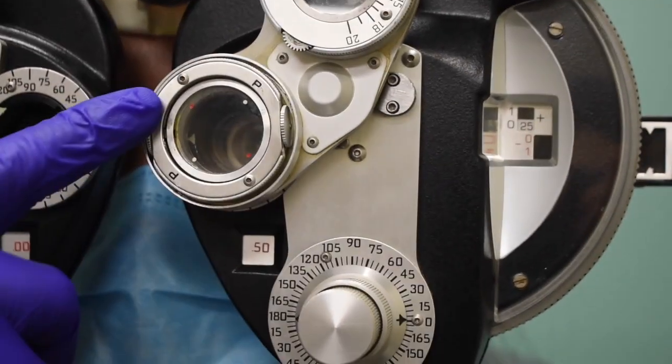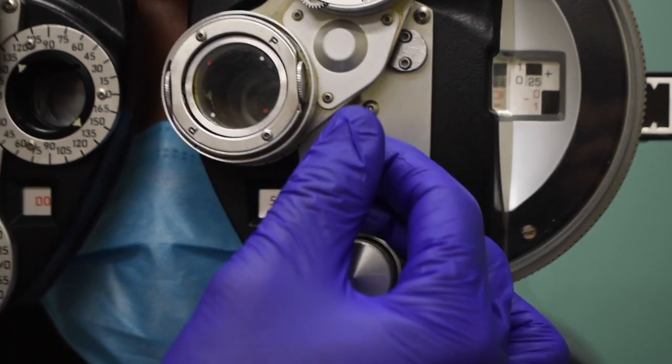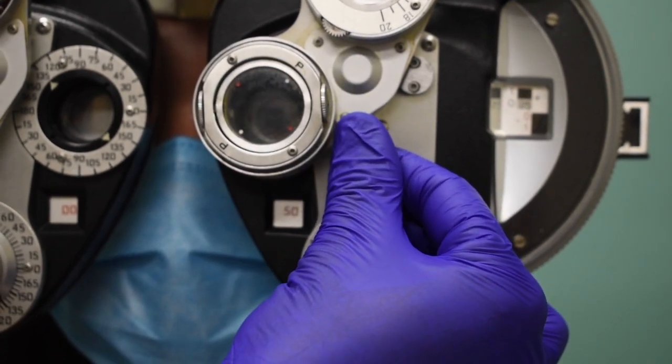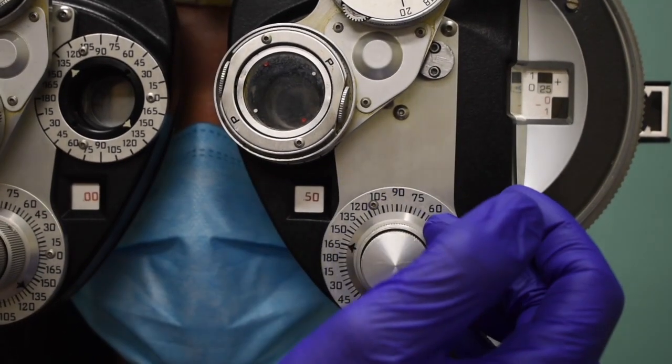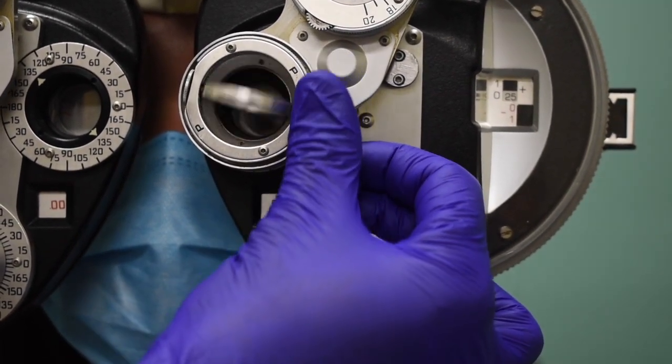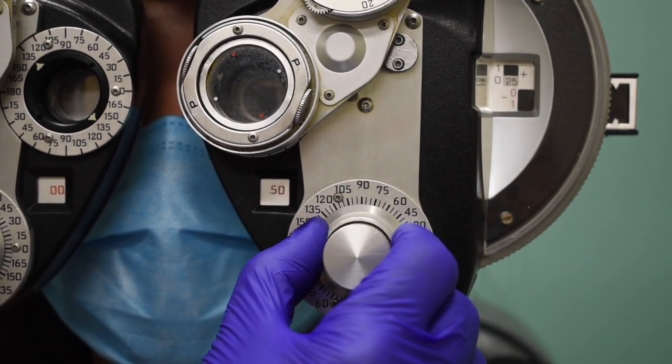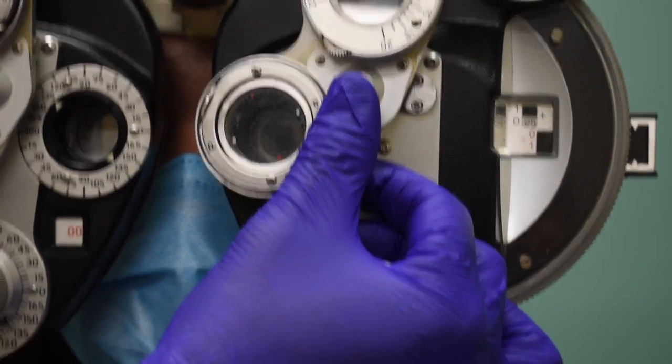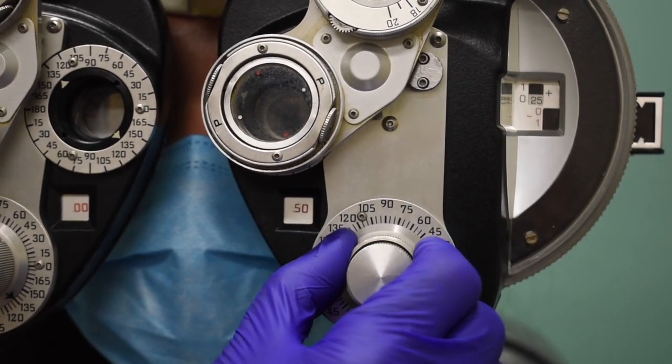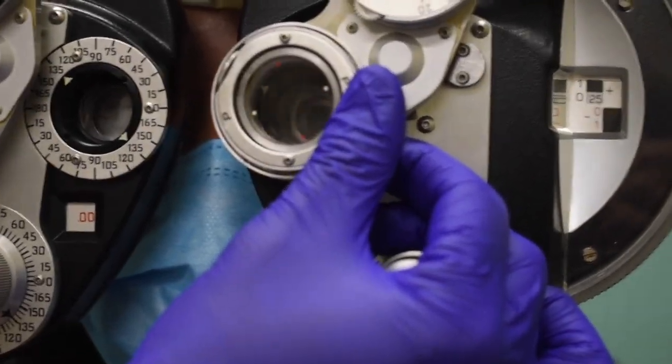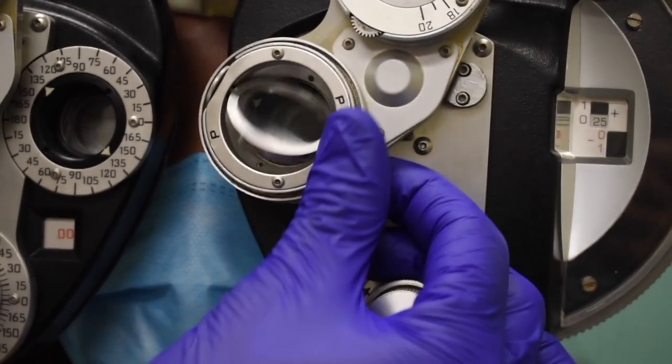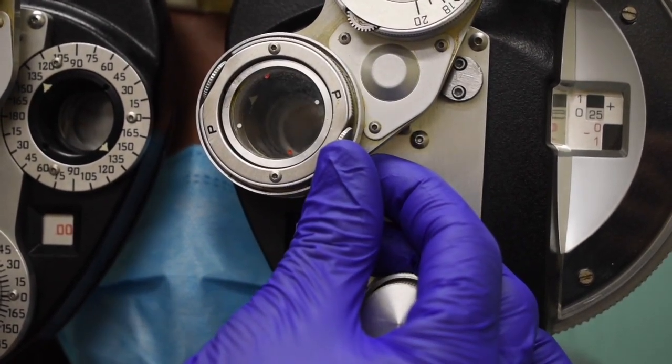We rotate it so that now the dots are straddling our axis indicator arrow. And we are going to be chasing the red here. So Phoebe tell me what's better, more clear, one here or two? Two. Excellent. Fifteen degree step to begin with. How about one here or two? One. A little bit sharper there so ten degrees more. And watch how the flip goes. We always want to make it one smooth flip across. One or two. Two. Great. So five degrees more. We never want to do a half rotation. We want it to be a nice smooth full flip. One or two? Two.